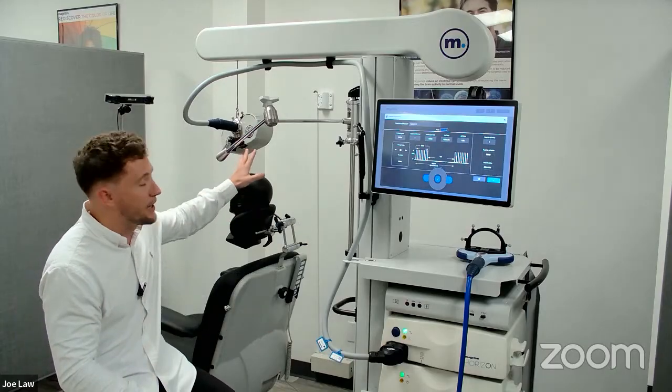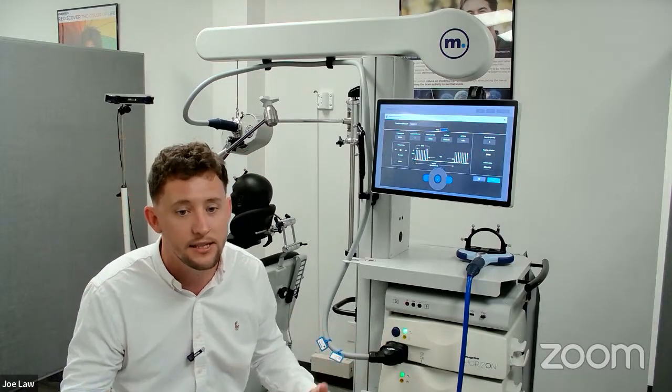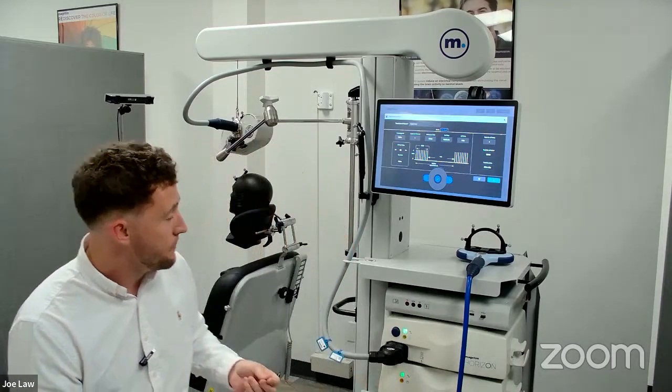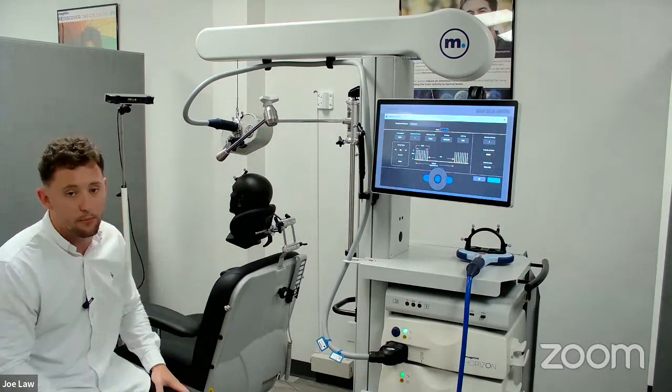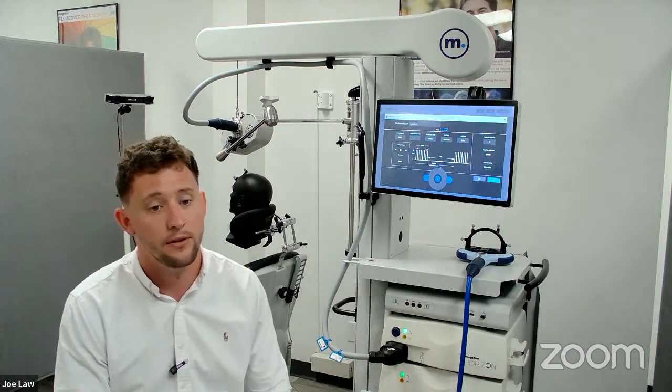So as long as you stay within our operating temperatures, that fan should not be loud. The actual clicking of the coil, which is traditional and standard with all TMS devices, should always be louder than that fan. But if you've got a hot clinic and you're giving that coil a difficult time to cool down, then it's going to have to be loud. We make sure that coil does not overheat and interrupt your patient's treatment, which is the number one priority here. So making sure that you have it within our operating temperatures, you should be fine. The fan should not be loud.